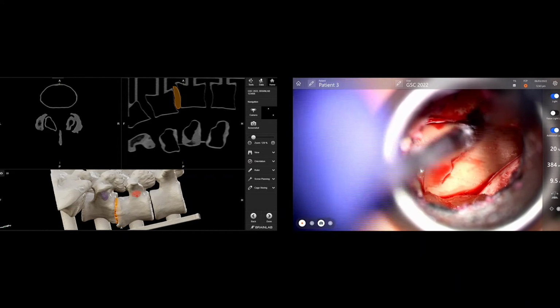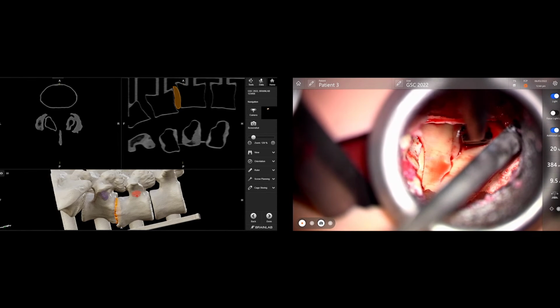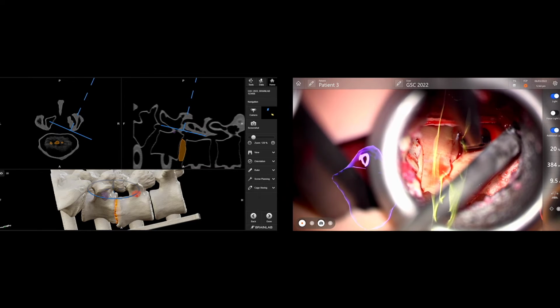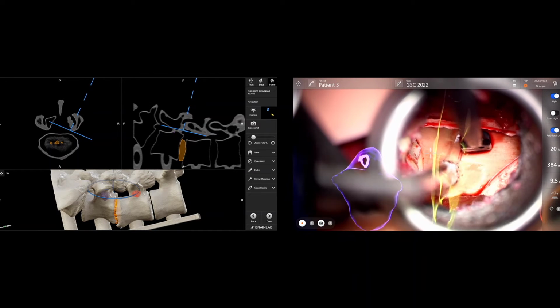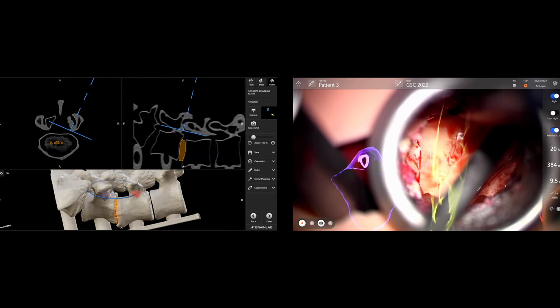And then we use the knife back, watch out, yeah. So I use the shavers. Oh, great. That's a pretty big one, but that's okay. I'll position you a little bit better here. You see that? You hold it there.